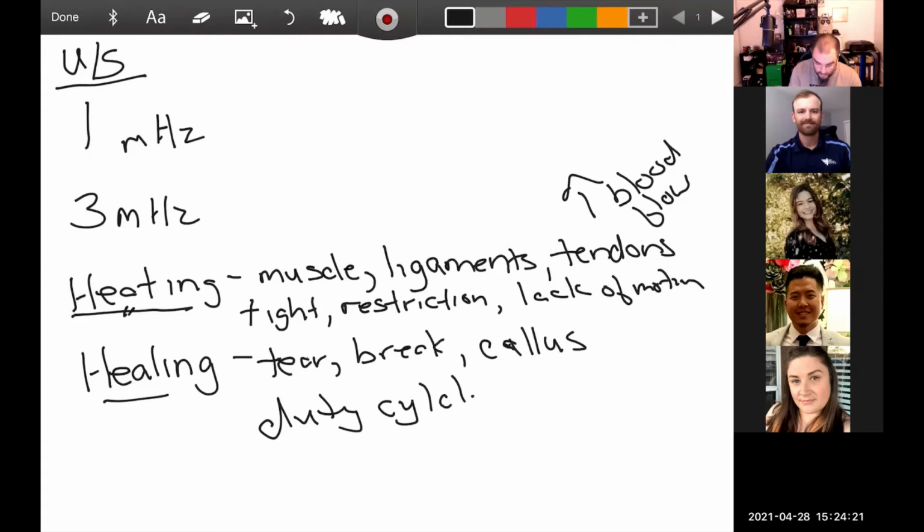Let's try to spell cycle right. So duty cycle is what we talk about when we're talking about it being continuous or pulsed. Do you remember that? So which of these, heating or healing, is continuous? Heating is continuous.